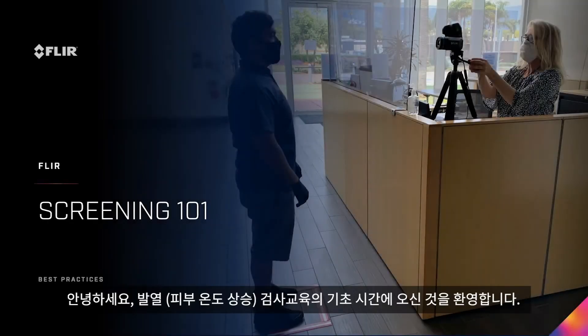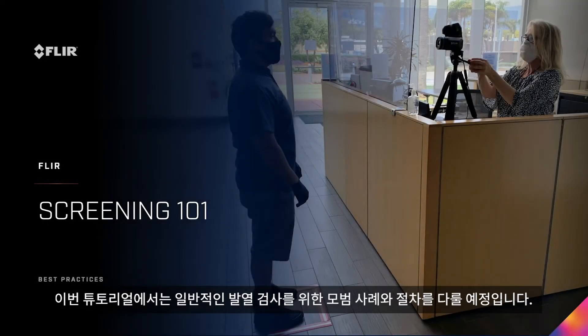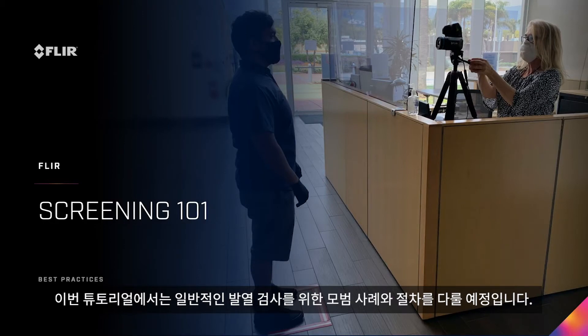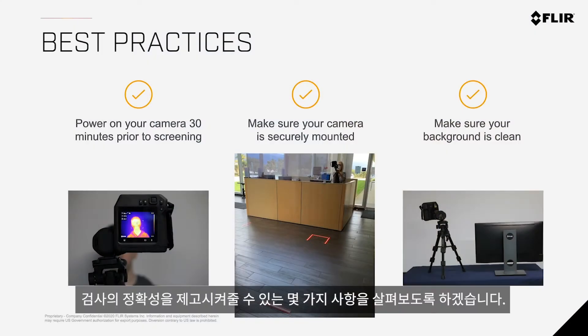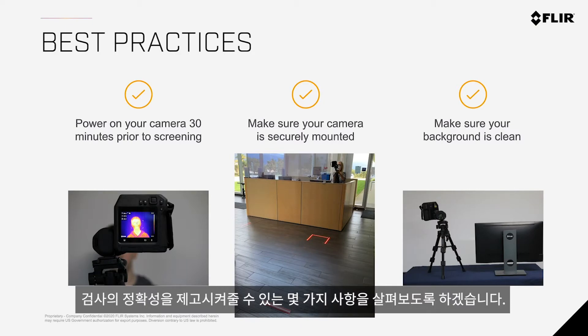Welcome to EST Screening 101. In this tutorial, we will cover best practices and procedures for day-to-day screening. Before we jump into the screening process, let's first go over a few things that will help make your screening process more accurate.